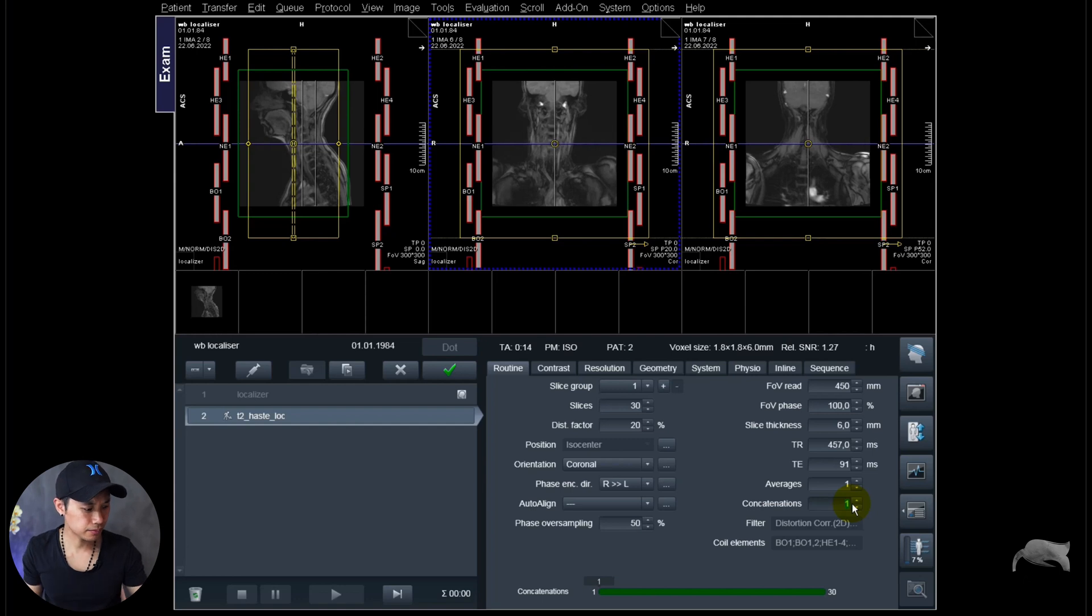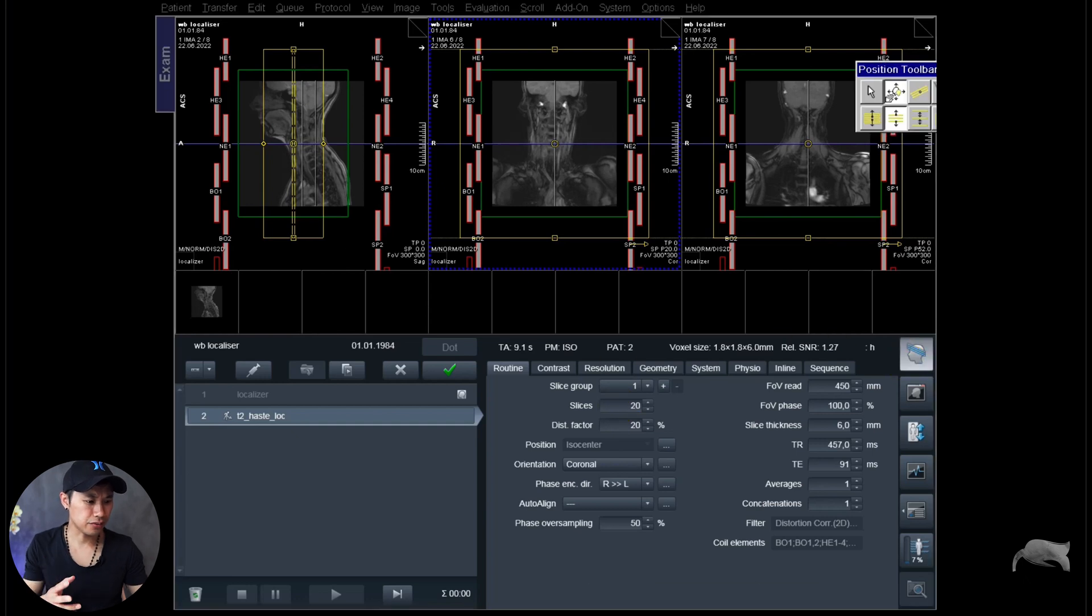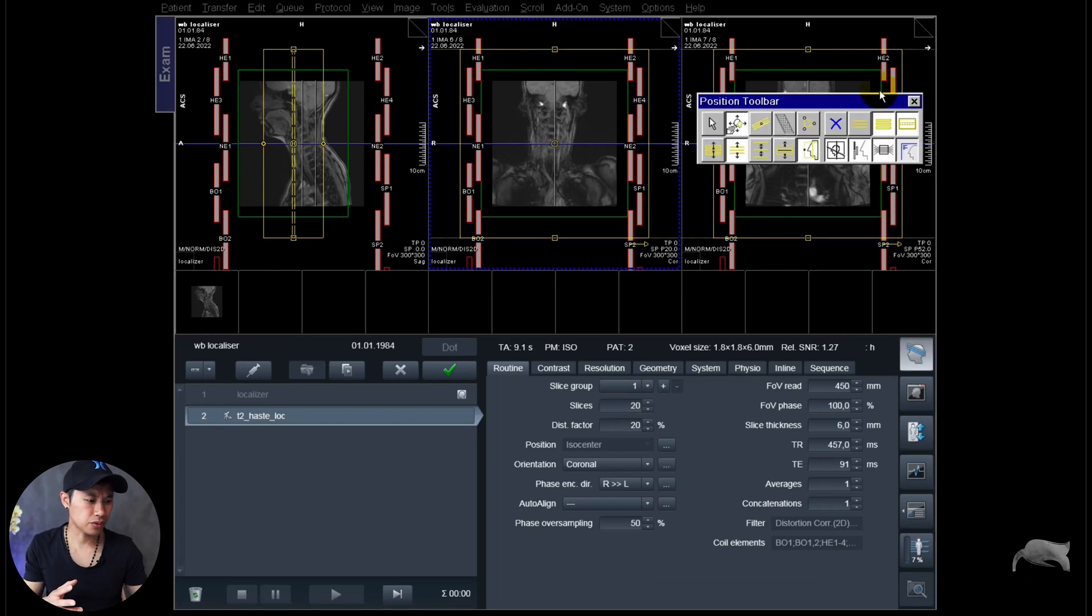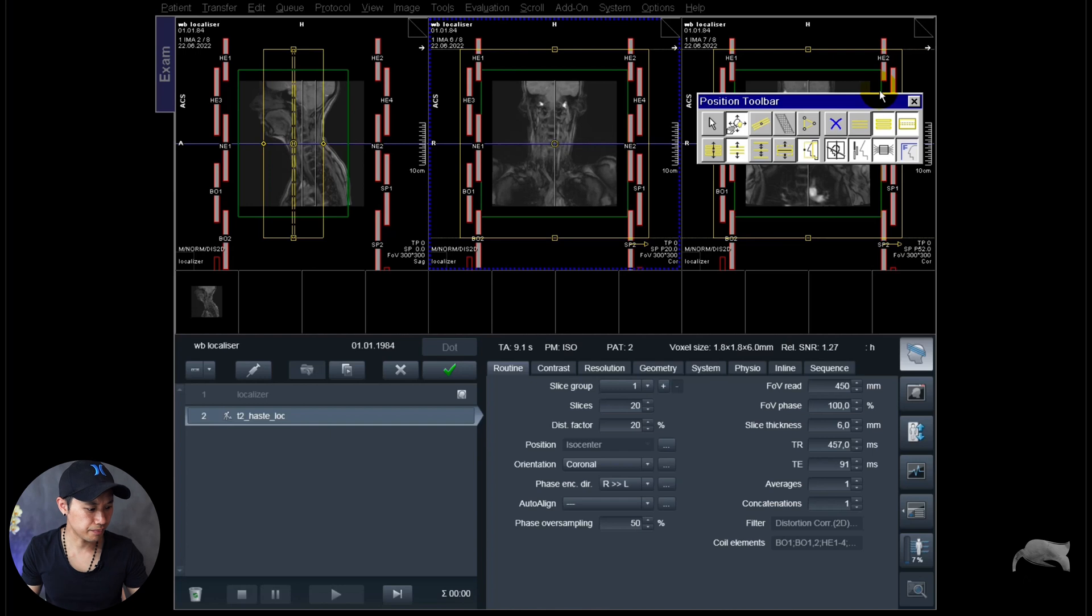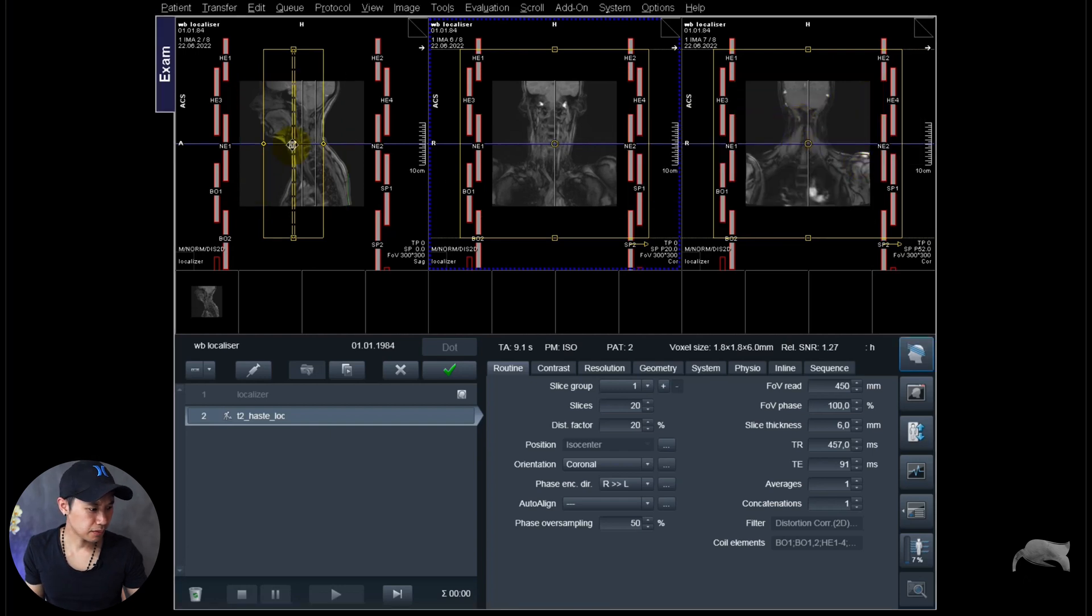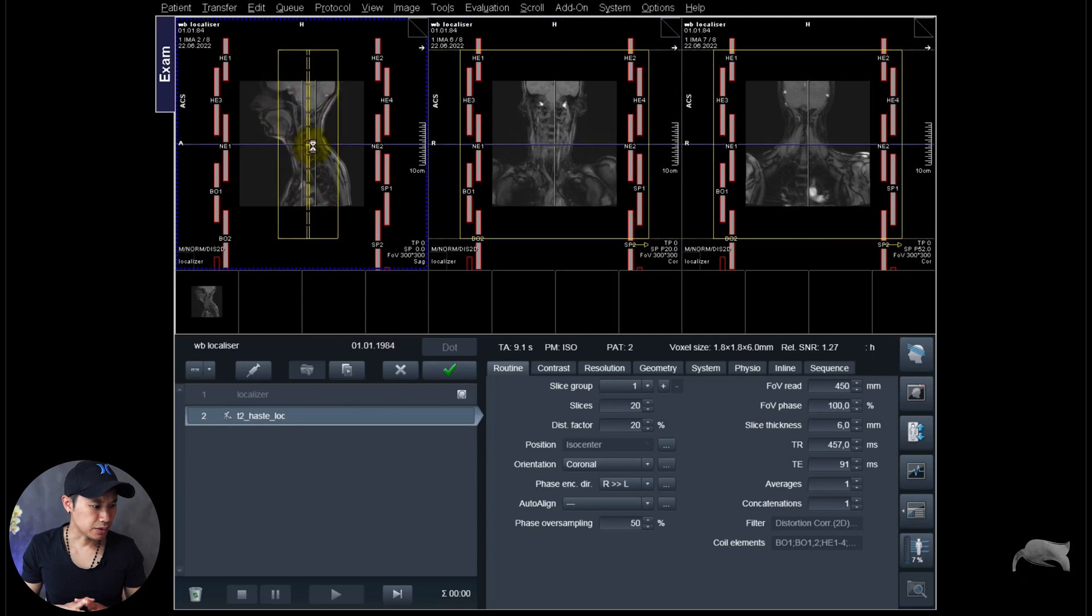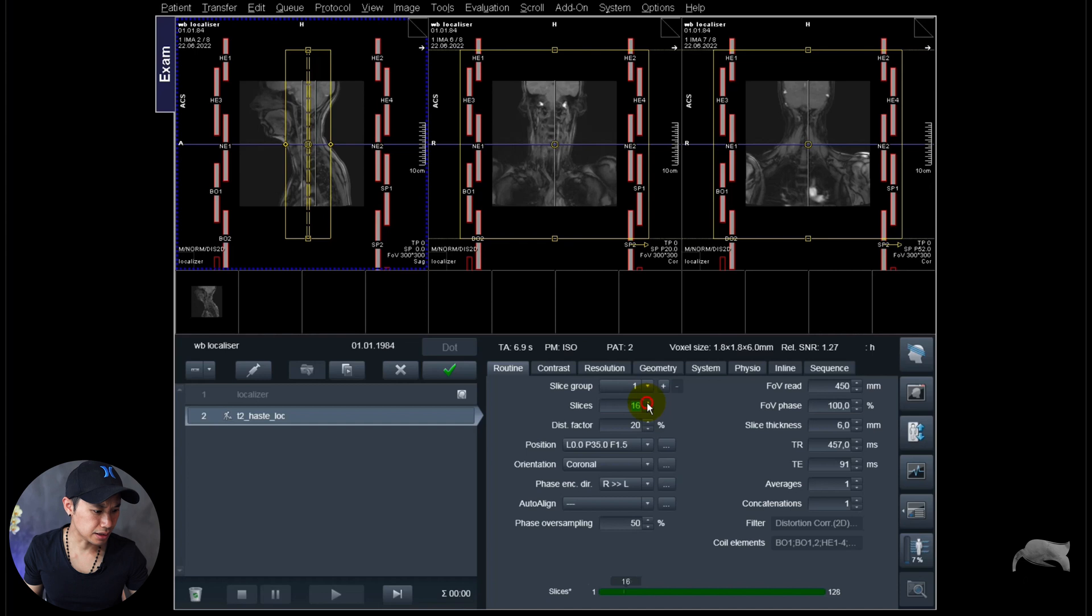And one concatenation so it won't stop in the middle of the scanning, so it will run as one because it's not multi-breath hold. And I don't need 30 slices in coronal plane, I just need a fast overview. And I just want to turn off the green shim like that. Now let's place this one. I think 15 slices is enough, 15 or 16.